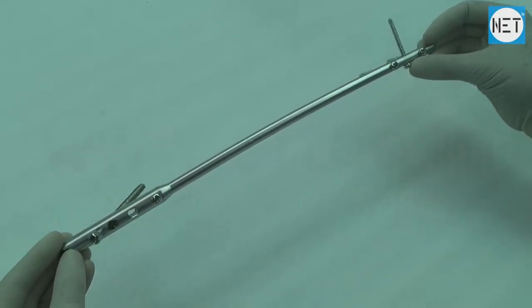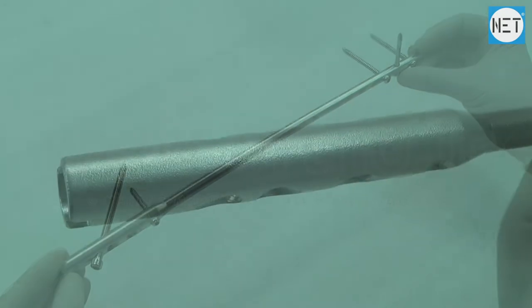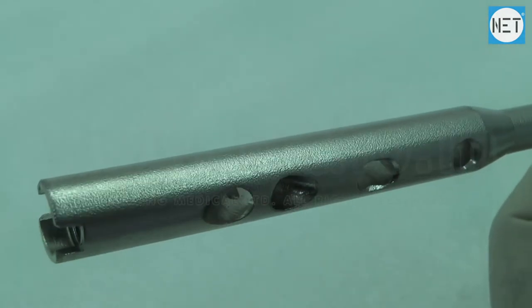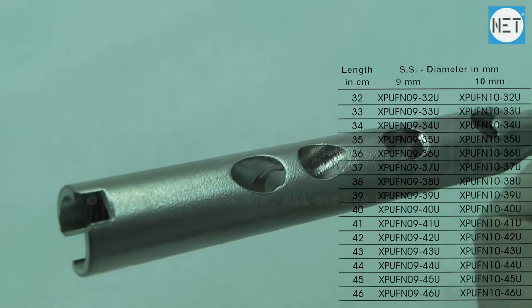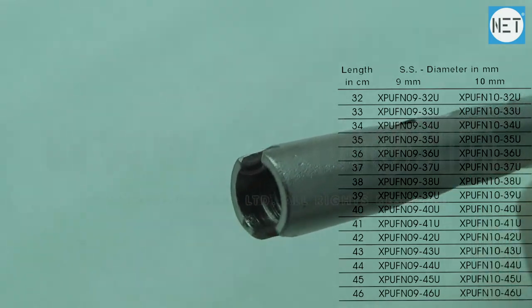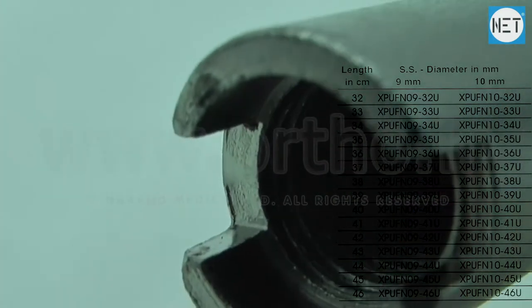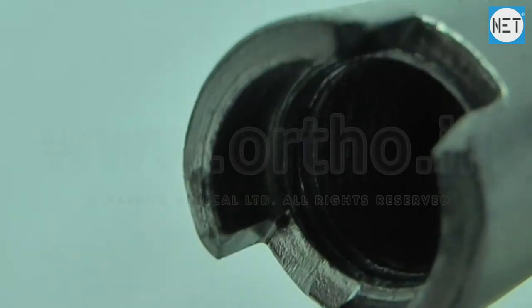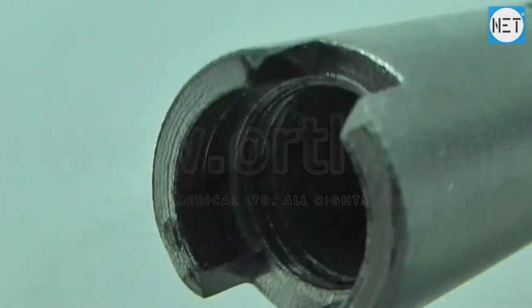The same nail can be used for right and left legs. These nails are available in lengths varying from 32 to 46 cm and in diameters of 9mm and 10mm. They are available in stainless steel and titanium.